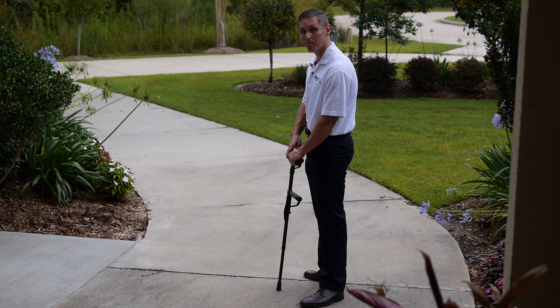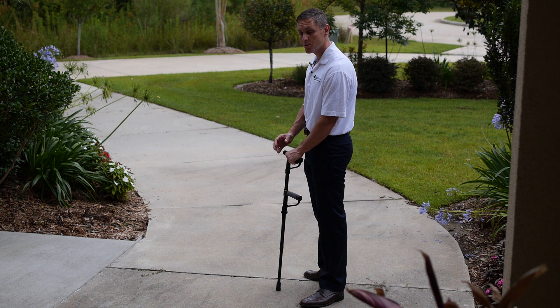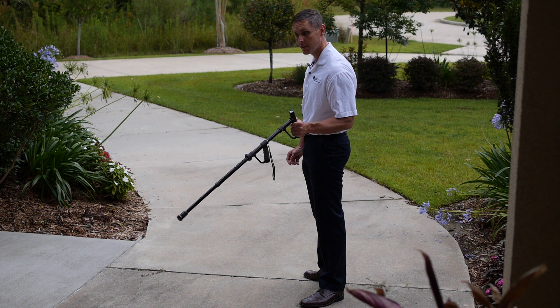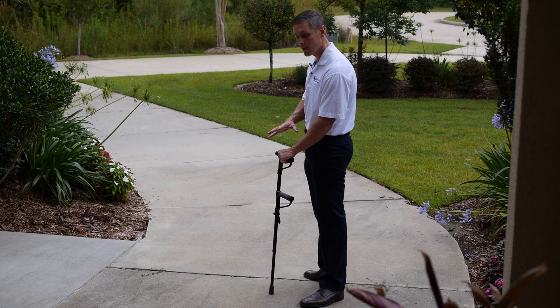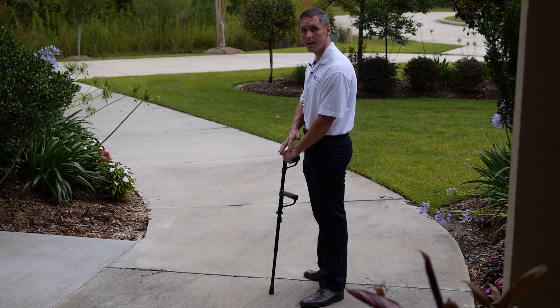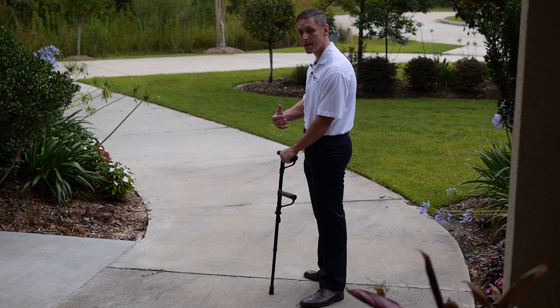In this video we're going to pretend my right leg is bad, so the cane goes in my left hand — even if it's my non-dominant hand — and the idea is the cane strikes the ground at the same time as my bad leg.